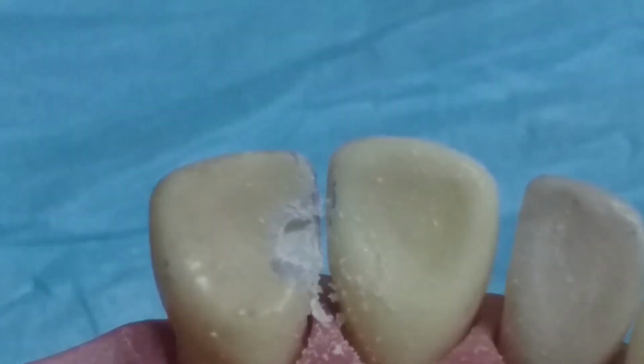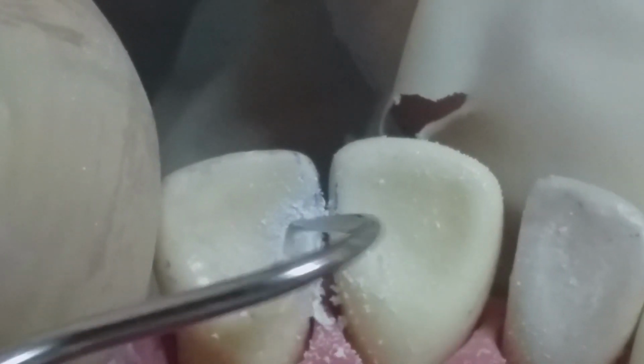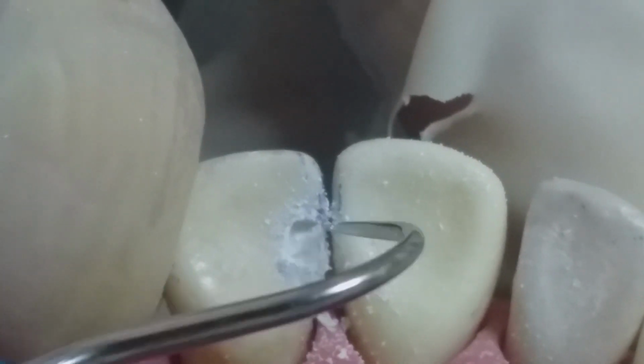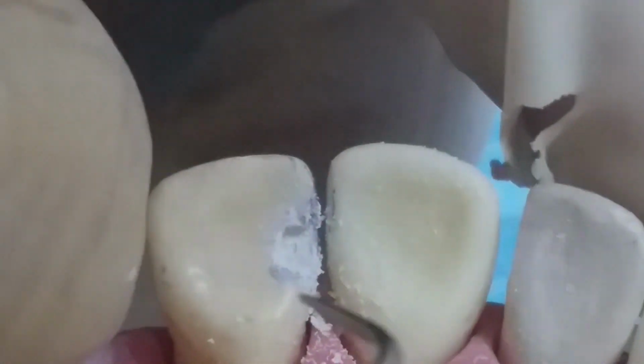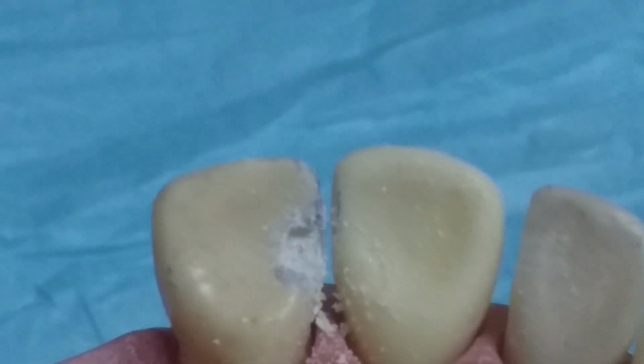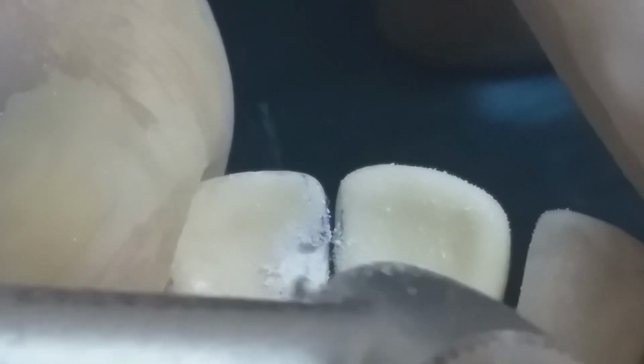Now, using a probe to destroy or to remove this shelf, like this, easily, very easy. And we will continue our preparation, but first we remove any roughness with this probe.